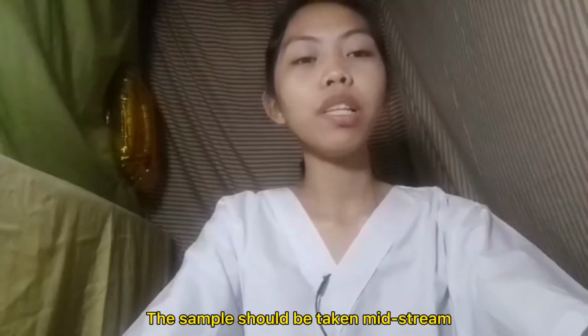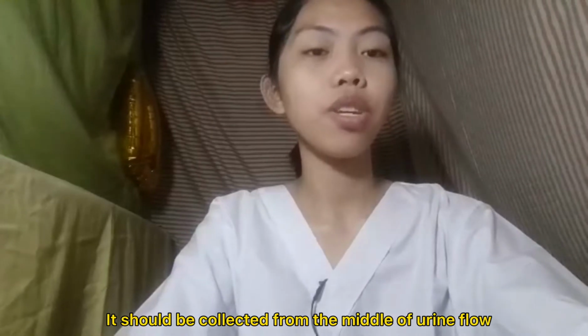The sample should be taken midstream, meaning it should be collected from the middle of the urine flow. This way, the first and last portion of the urine that's more likely to contain bacteria from skin are not collected. A properly collected clean catch specimen will help make sure any bacteria found in the urine specimen came from inside the urinary tract.